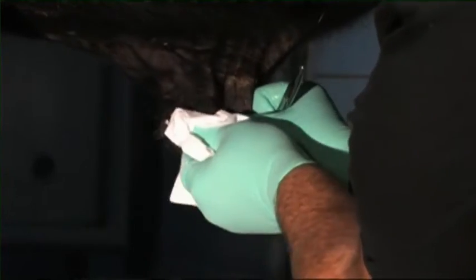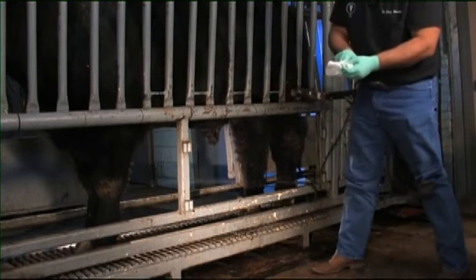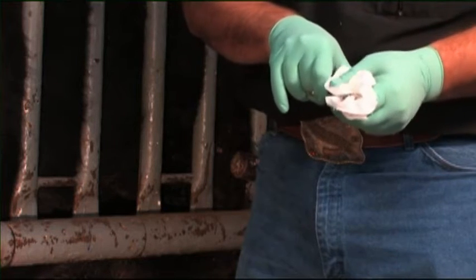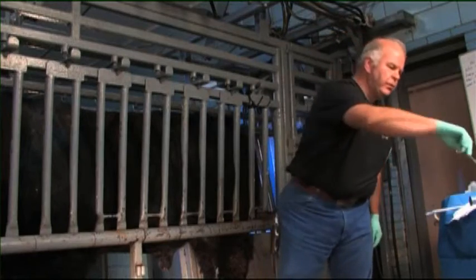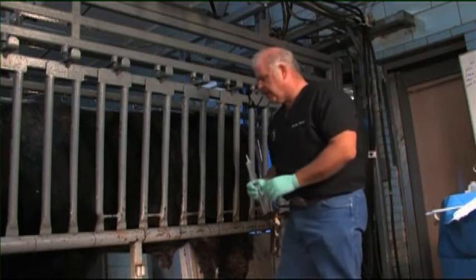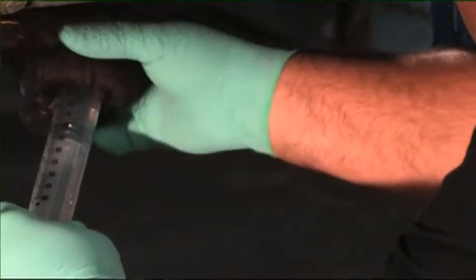And we'll dry the sheath with a paper towel if there's any excess moisture accumulation. After we complete the process, we wipe any excess hair or moisture from the scissors before you place them back in a disinfectant. For those bulls with dirt or debris in the prepuce, a minimum amount of saline is to be used to lavage the sheath.